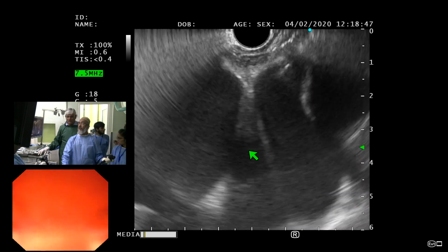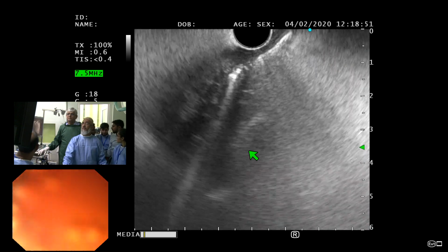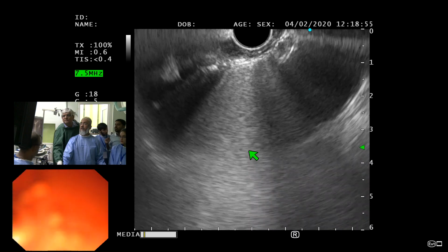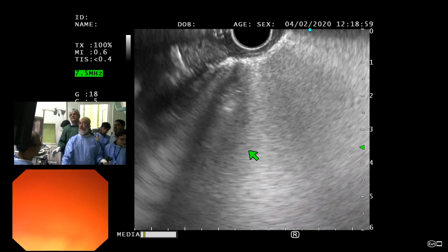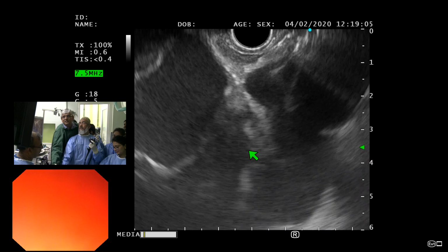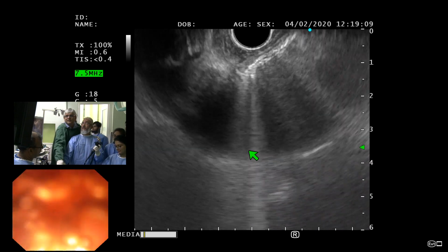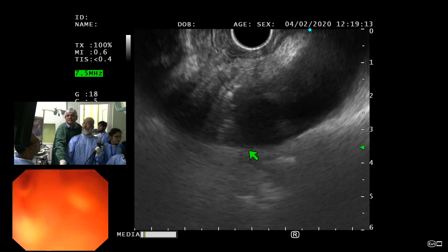Now for the arch. Yeah, she's getting a little restless. तो देख लो. When you're doing AP, just इसमें lymph node है क्या यार? दिखाओ. हाँ, there is a lymph node. इसको rotate करो. थोड़ा सा. Yeah, clockwise. Yes, sir. So you see there's a slightly biggish lymph node there. Yes.